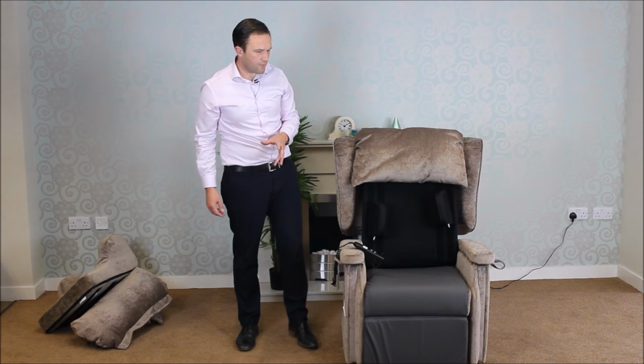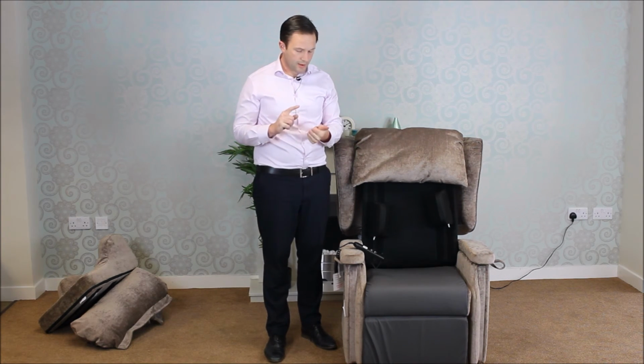So hopefully this has been helpful. If you've got a user that's not finding the chair comfortable, think about the transfers, the size of the chair, what cushion they've got and the posture. And hopefully in this way we'll be able to make the user comfortable.